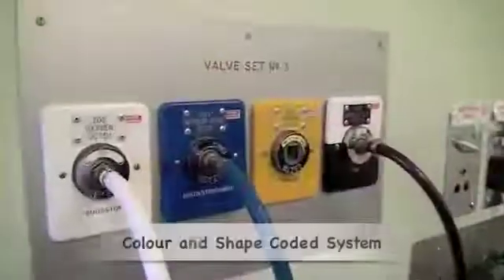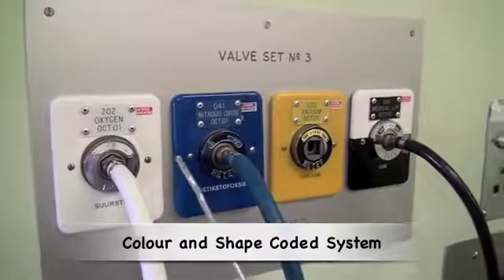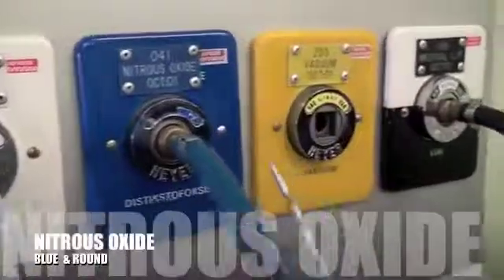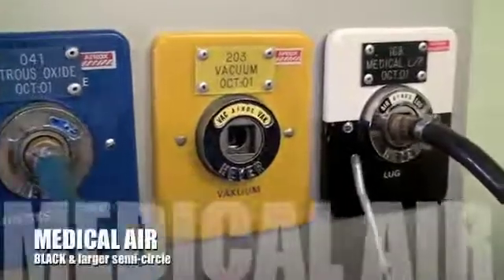Having turned the machine on and checked the power supply, we now move on to checking the gas supply. Each gas has a colour-coded and shape-coded system. Oxygen is coded white, nitrous oxide is coded blue, and medical air is coded black.